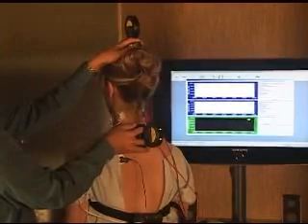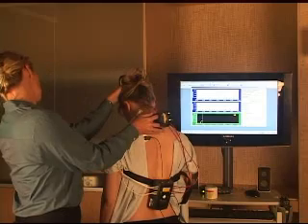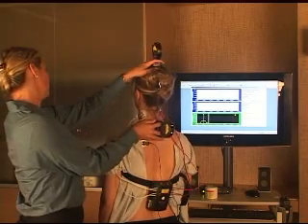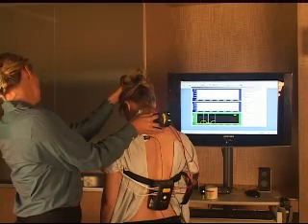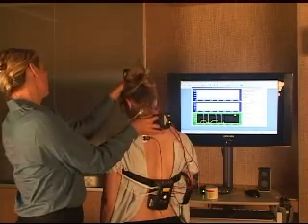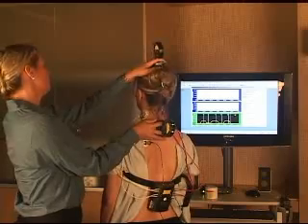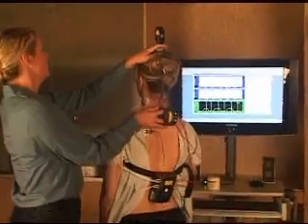We're placing the probes so that they're on top of the head and at approximately T1, and we perform 3 flexions in a row. We mark it when they're in full flexion, return to neutral, wait for the muscles to relax, mark it, bend forward in a flexion, wait for the muscles to hit a low, mark it, back up to neutral. Now we're watching the screen, waiting for the readings to relax, mark it, back into flexion, mark it again, return to neutral, wait for the readings to drop. So we're hitting it at all the lowest points and marking it.